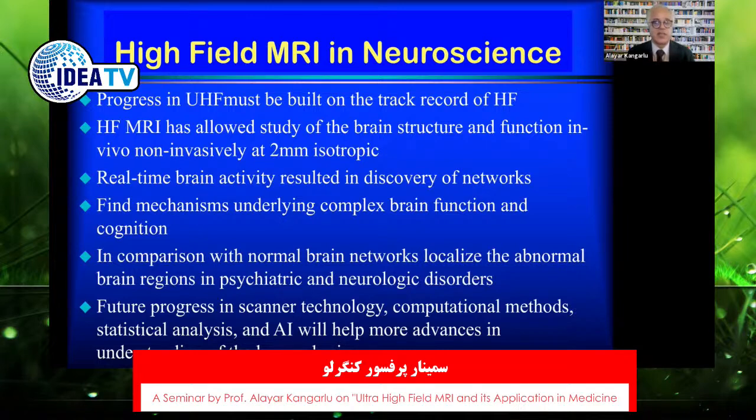This way, people have been developing hyperpolarized helium so that the patient inhales a balloon full of helium-3, and they have been able to produce exquisite pictures of the human lung.